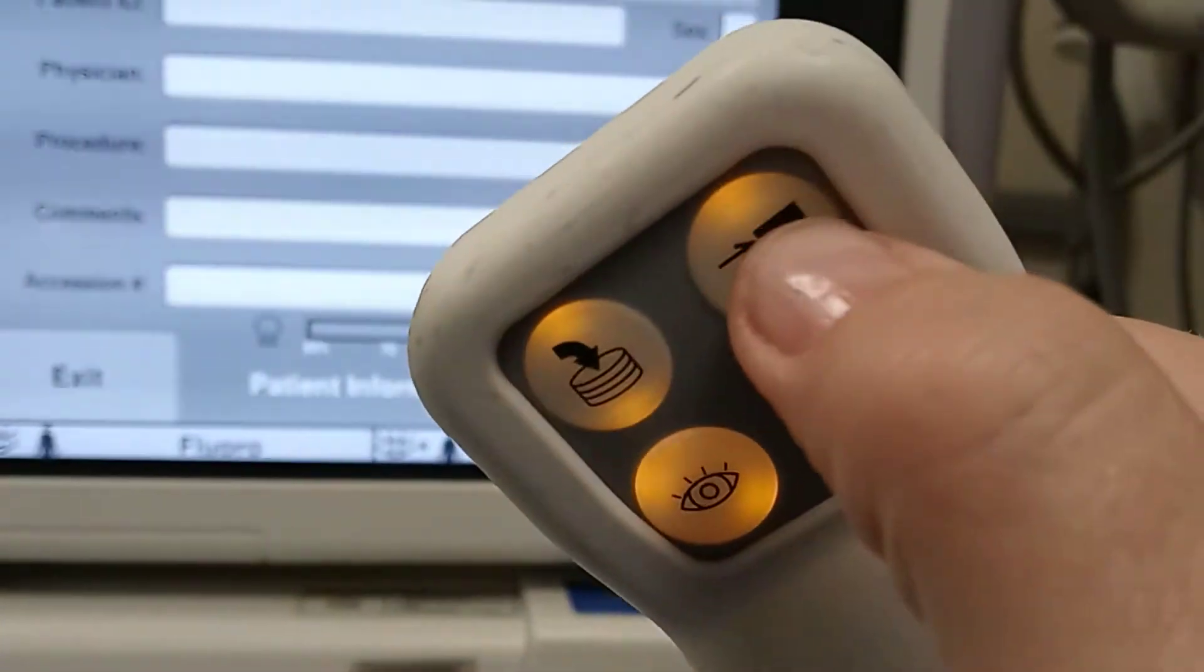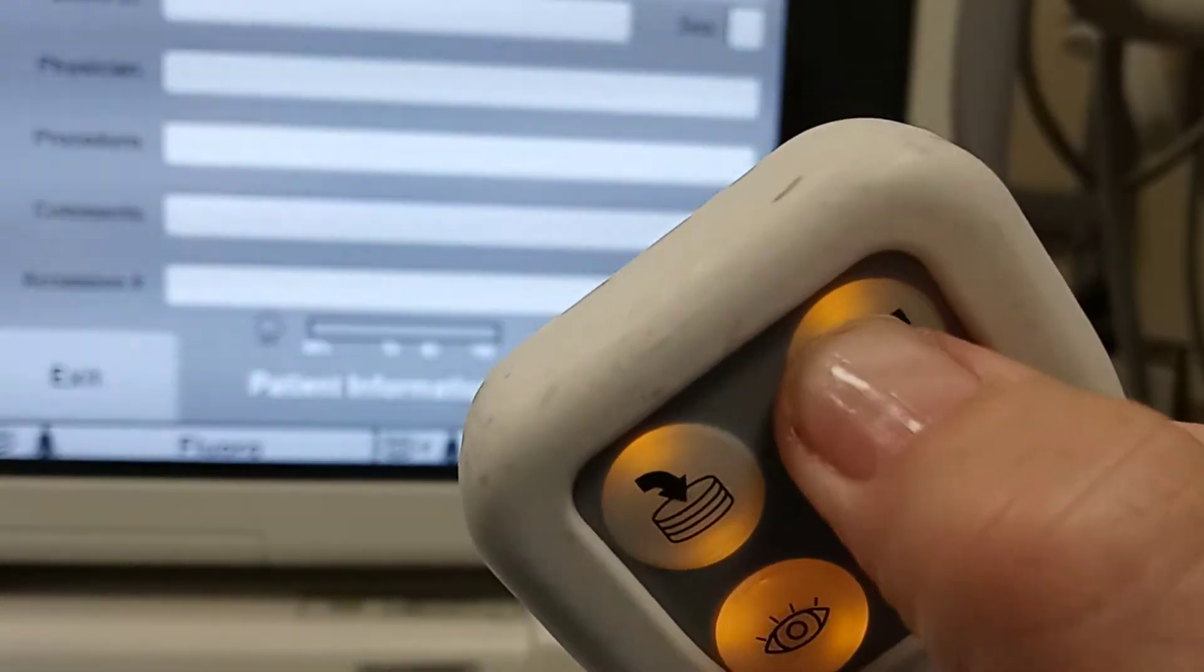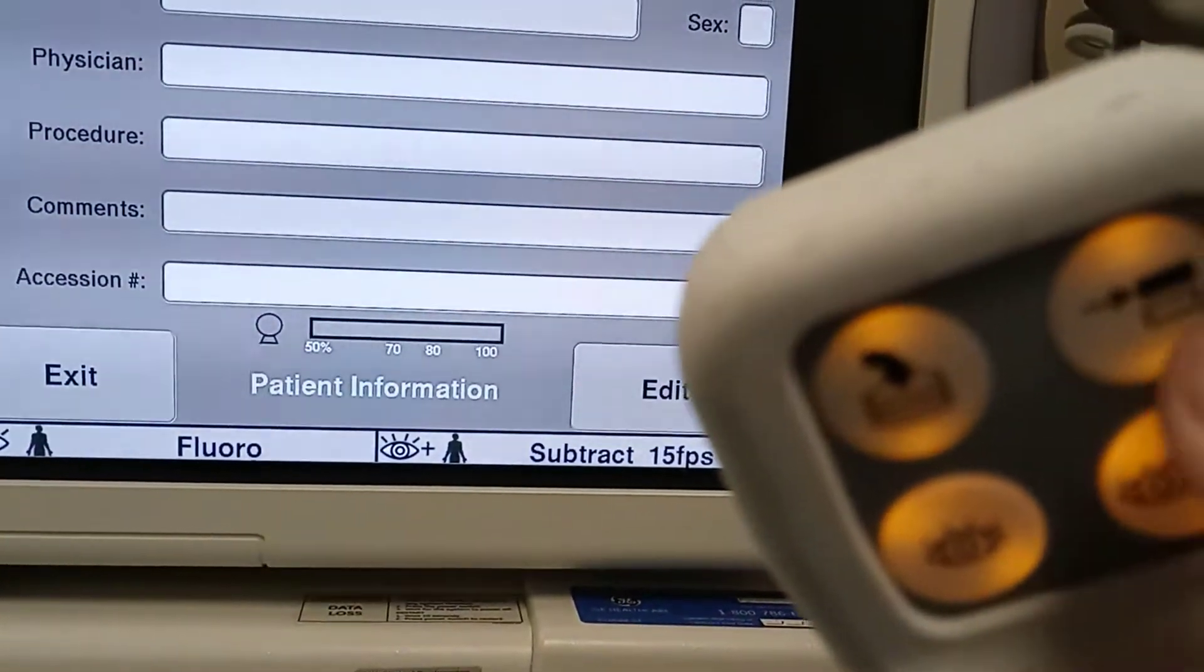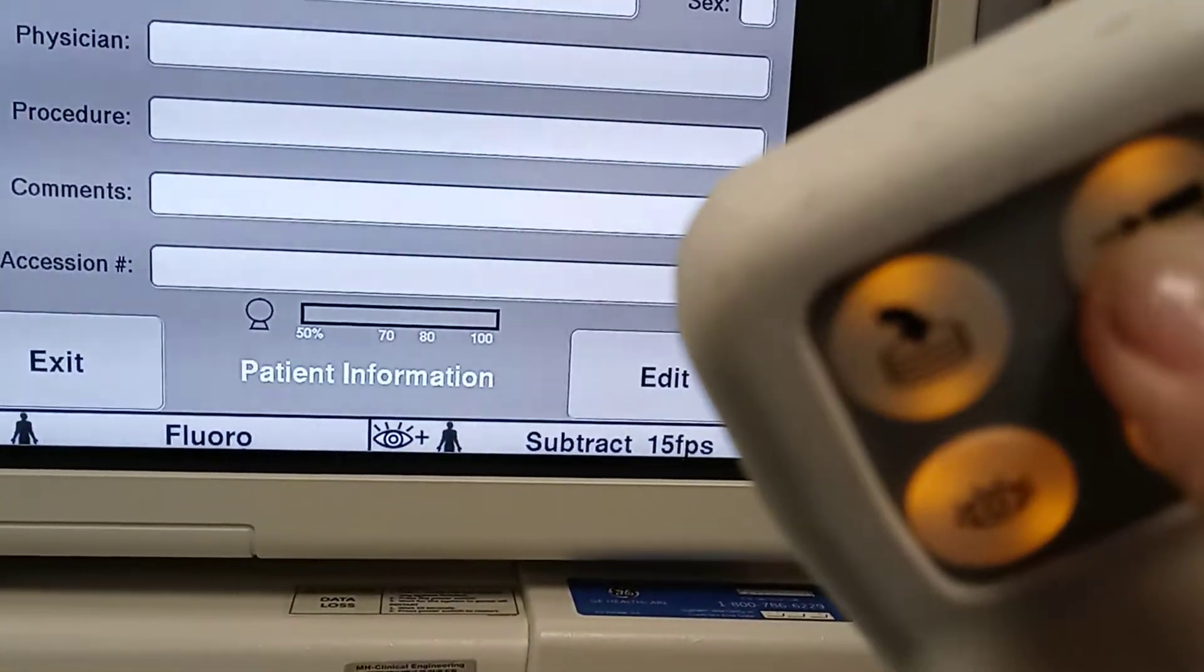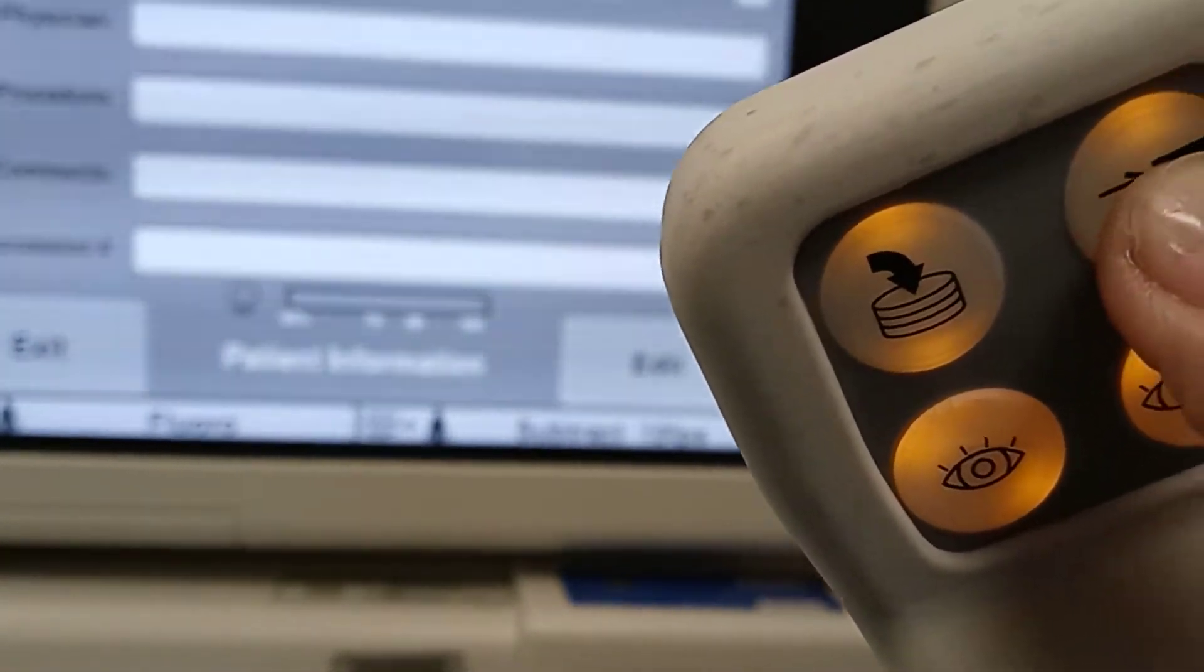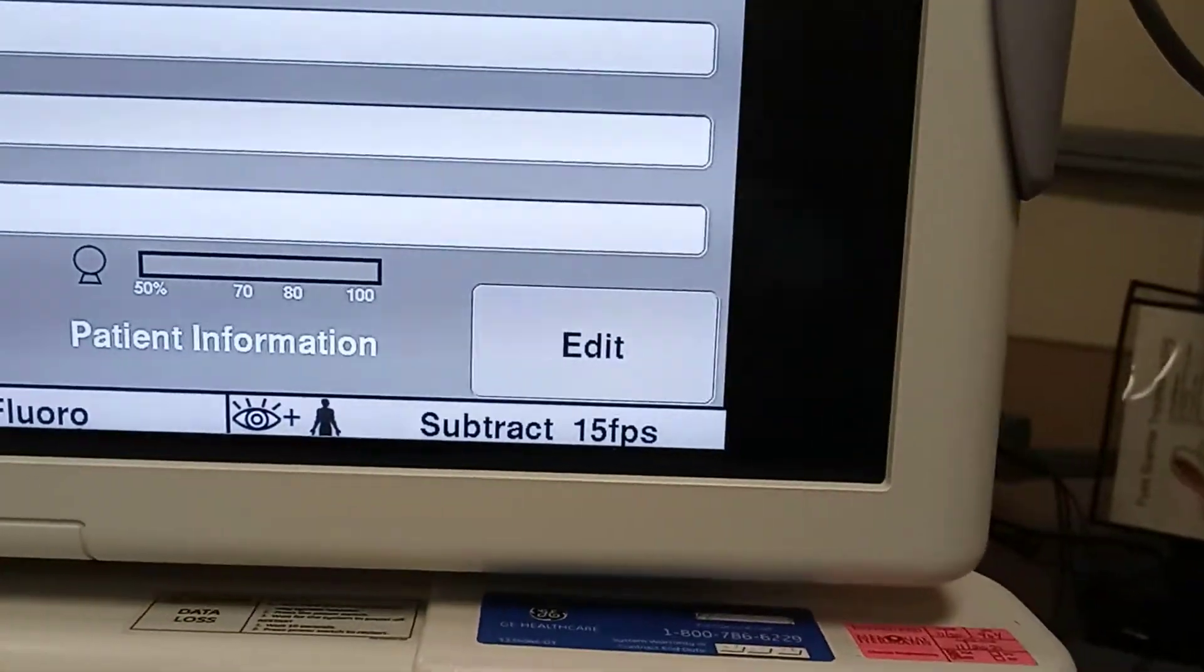I'm going to change it using my mode button. Here's my mode button. Subtraction change. As I poke it, you can change it back and forth from high level fluoro to subtraction.